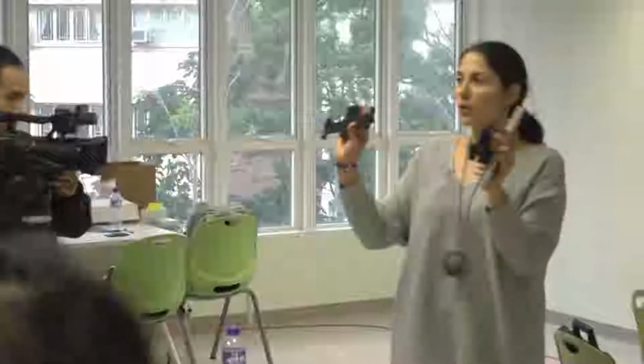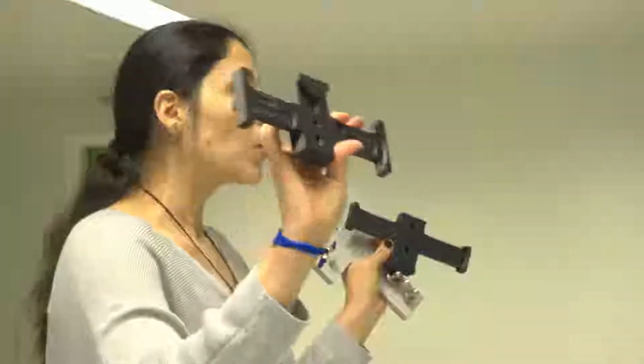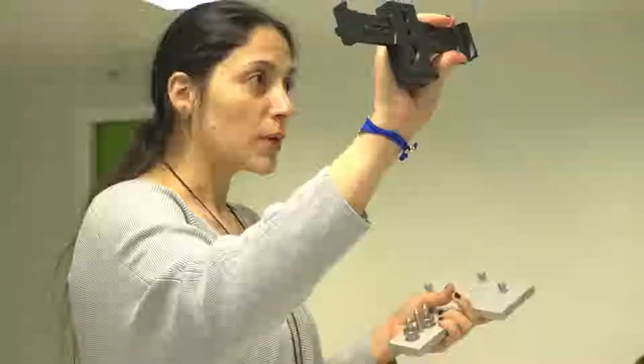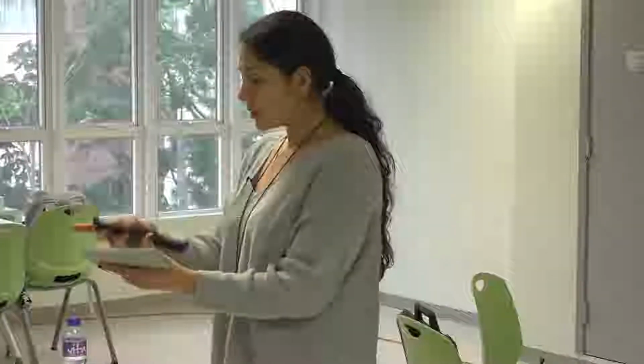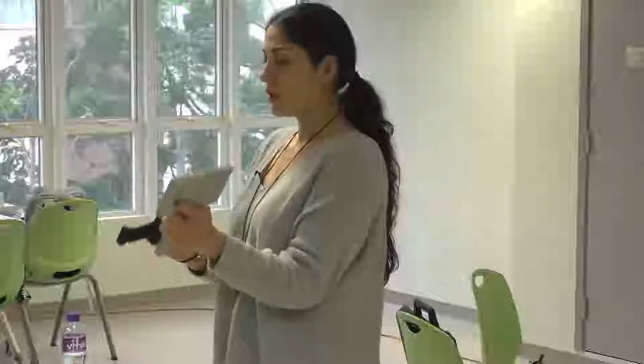You have these two things, and you can read here, it says Duo Max BF for the cool coil. So when you are going to calibrate the cool coil, you need to use this one. And when you're going to use the other coil, you need to use this one. So pay attention to it, okay? Because this is a mold exactly for the coil you want to use. And you want to put it in this way, okay? So you put the coil here.